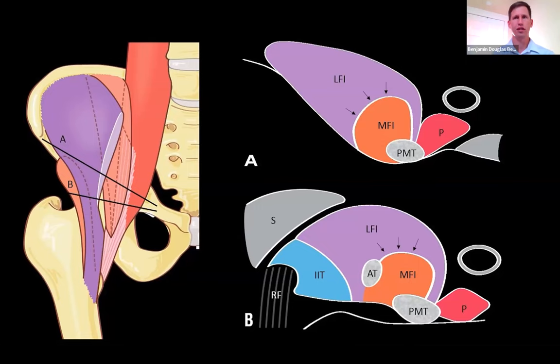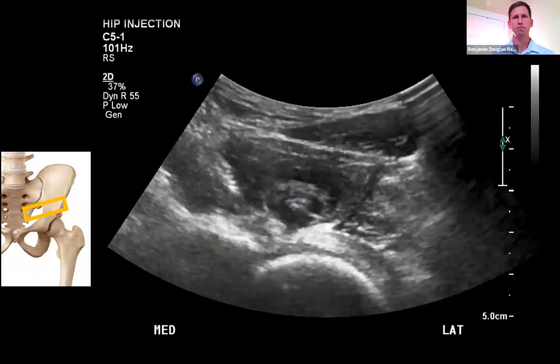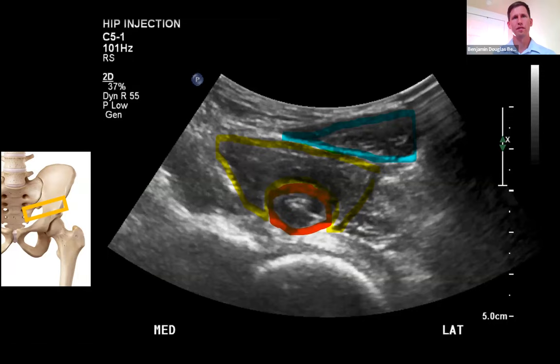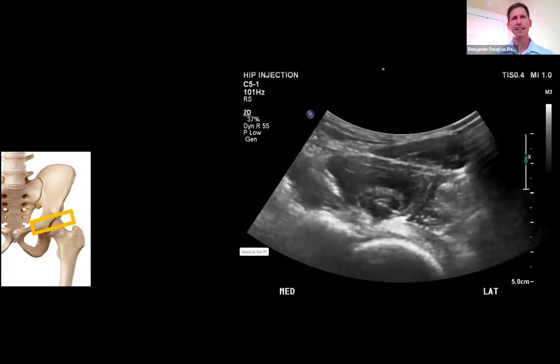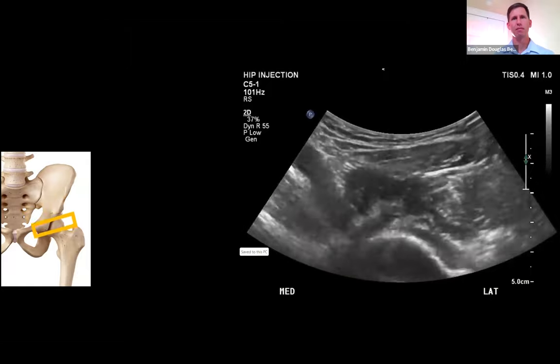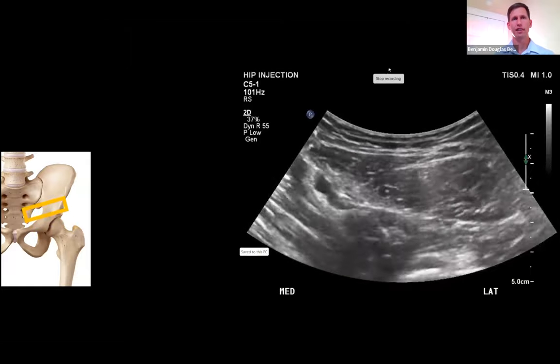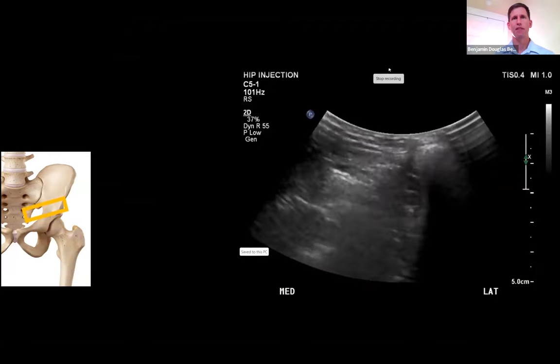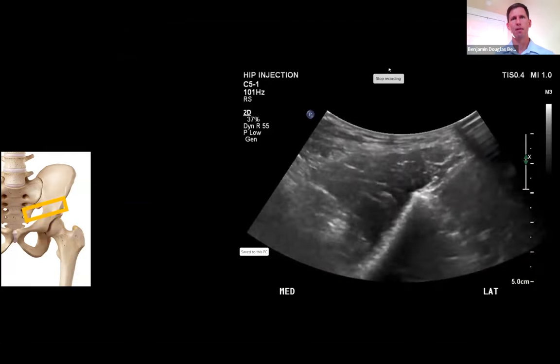On ultrasound we can identify the sartorius, the lateral portions of the iliacus, the medial portion, the psoas muscle, and where the star marks the iliopsoas tendon. Here we can see the scan moving cranially to caudally and back, evaluating the iliopsoas muscle and tendon.